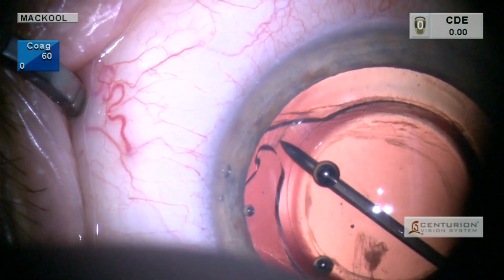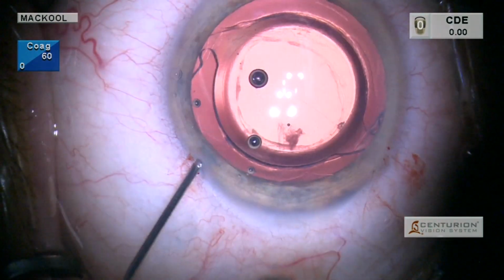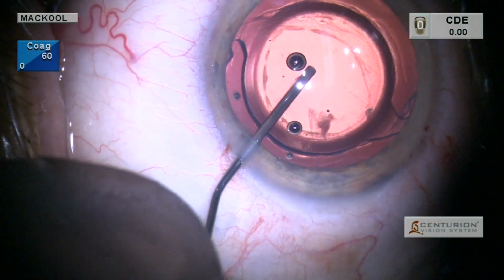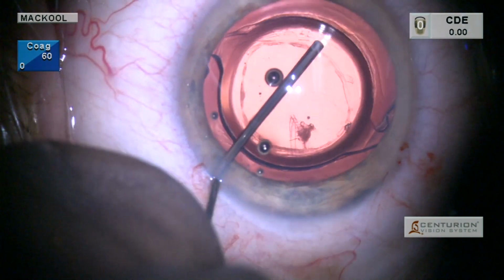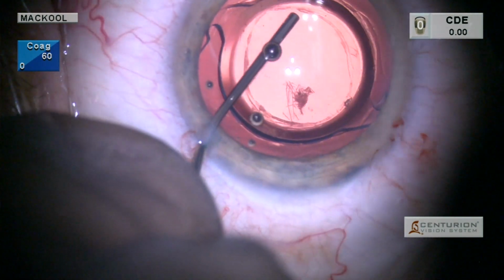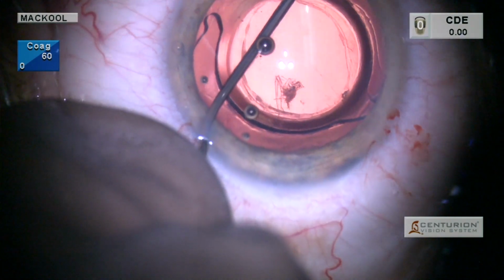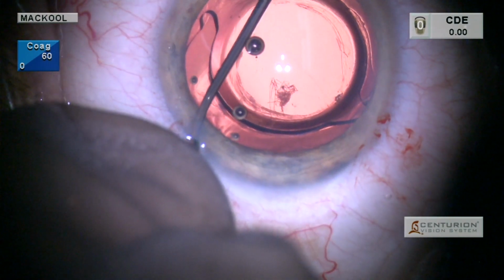And then when I think I've gotten far enough underneath the capsule, I'm going to inject. And you can see to the right there the OVD dissecting between anterior and posterior capsule leaflets. It typically won't go too far, however, because with an open posterior capsule, the path of least resistance is going to be posterior.